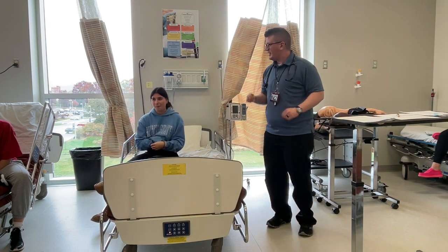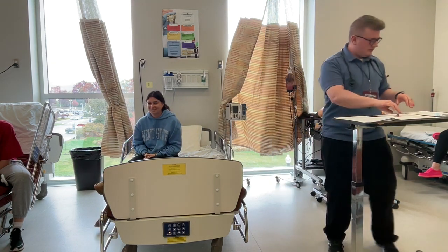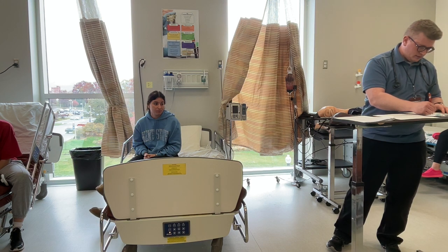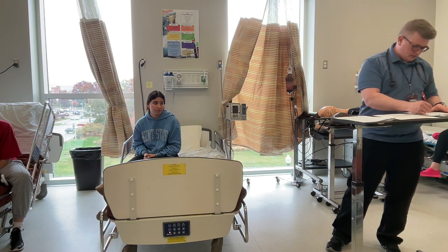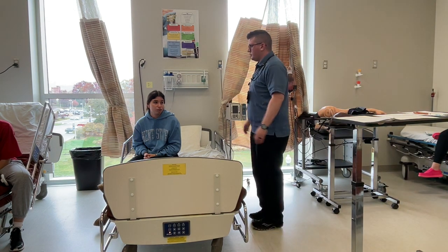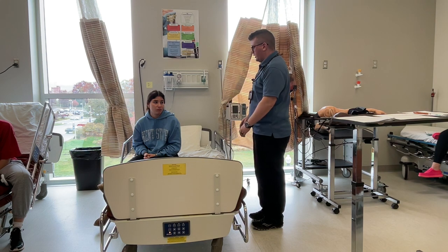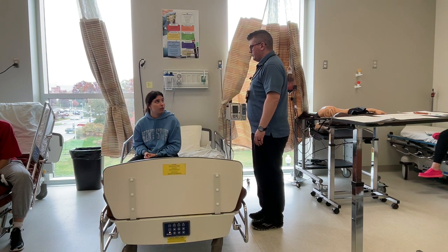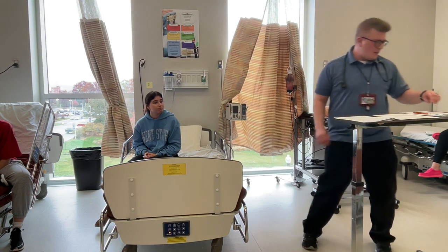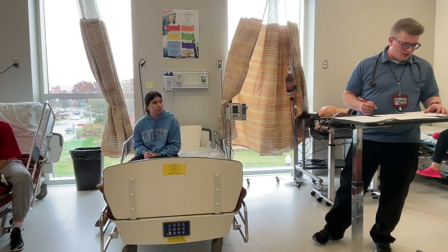Perfect. Are you having any pain today anywhere? 0 to 10, 0 being no pain, 10 being the worst pain of your life. Not any pain right now. Great. So I document all the vital signs and the pain, and we're just waiting for that temperature.